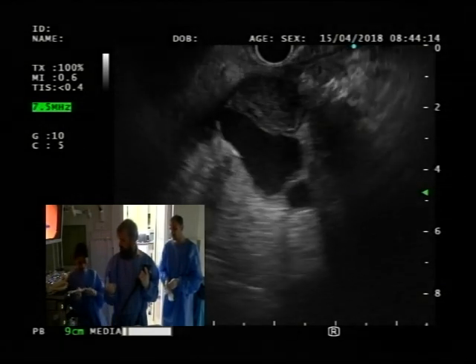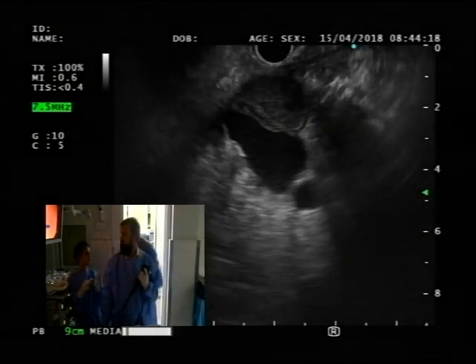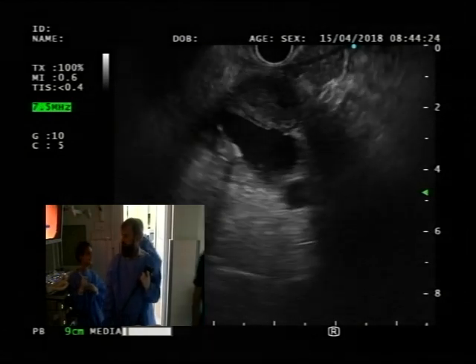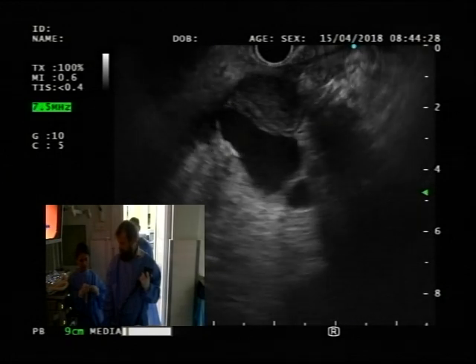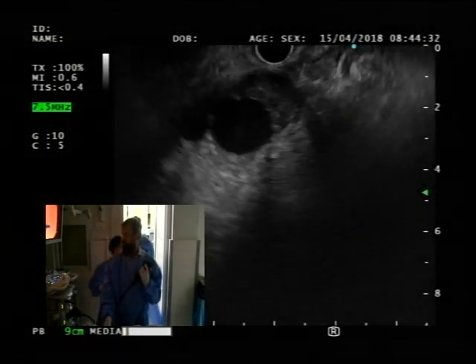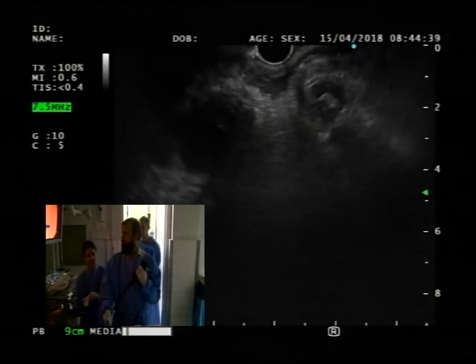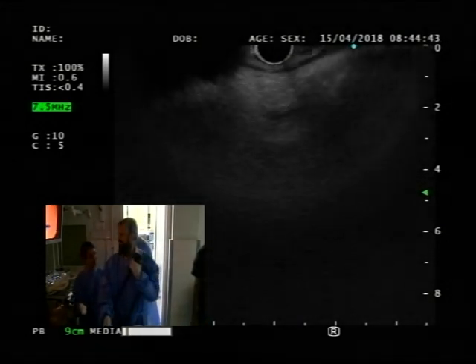Wasim update. Sir, what should I mention in the report? So dilated portal vein with a suspected clot in the portal vein, FNA performed to rule out malignancy. ठीक है? And atrophic pancreas and suggestive of chronic pancreatitis. Looks like a clot, fibrin type of material.